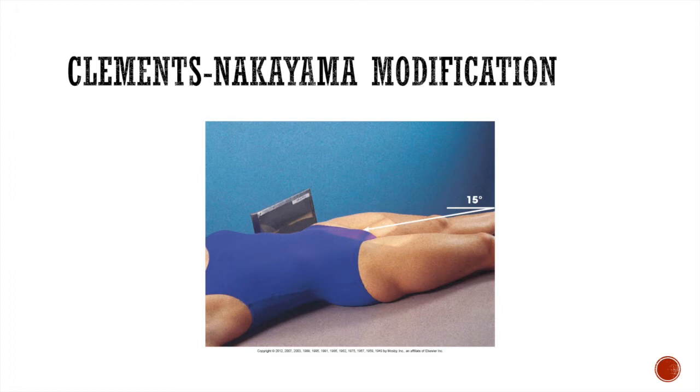So the central ray is going to be centered to the IR, and you're going to collimate to about 10 by 12 inches or less, and of course include the marker, but don't have it in the anatomy. Shield the chest and the abdomen if it's not going to obscure the anatomy of interest, and use the technique chart for exposure factors, about 80 kVp using AEC. And you should see the acetabulum, the femoral head, neck, and trochanters.